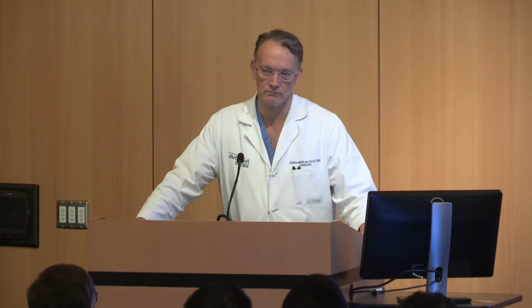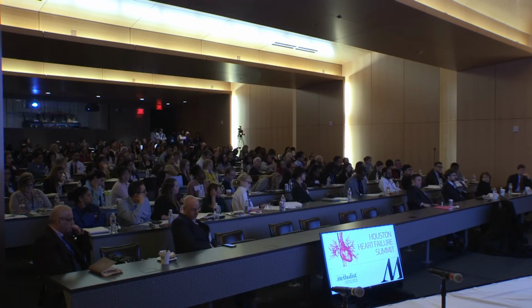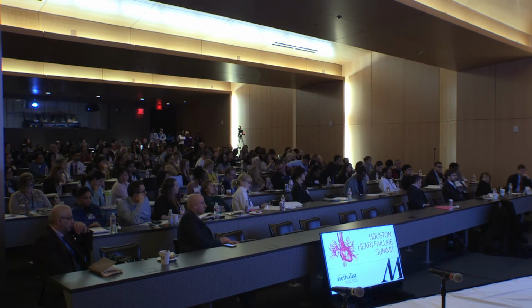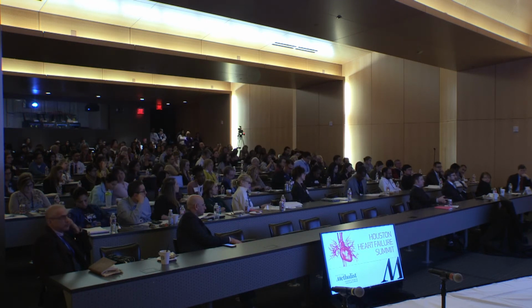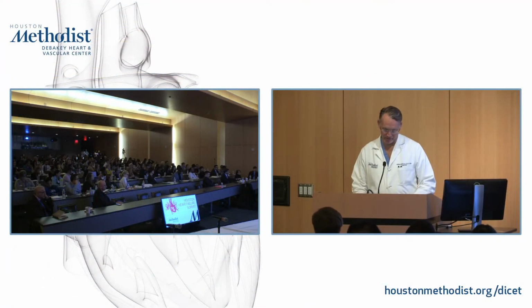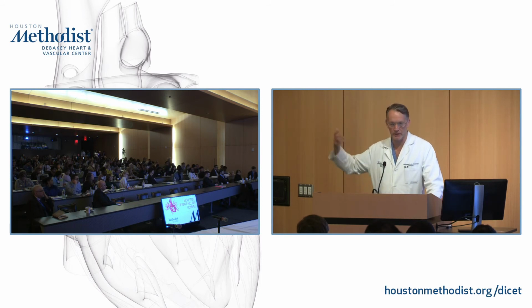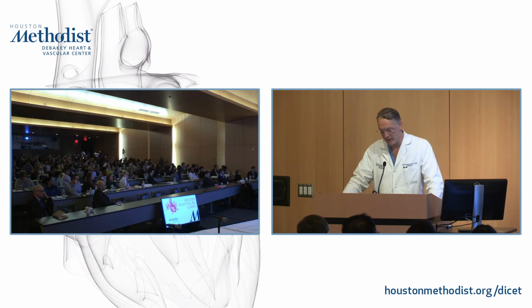Colin, real quick, I know you mentioned that choosing the right patient is a tough task, especially with these early interventions in the tricuspid valve. Just based on the limited experience, and I know we're just starting to do these valves, what would you recommend to referring cardiologists in terms of which type of patient should be considered for tricuspid valve intervention? I think anyone who has symptomatic moderate to severe TR who doesn't have some other reversible cause for it, untreated pulmonary hypertension, some obviously left-sided lesions, and doesn't have some hugely dilated heart with biventricular failure.